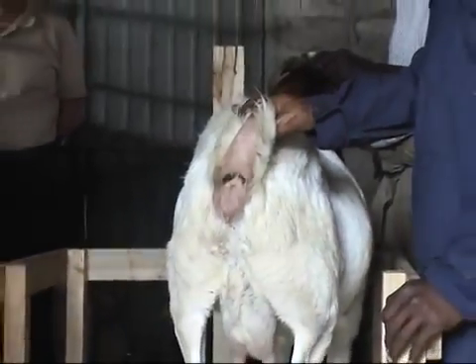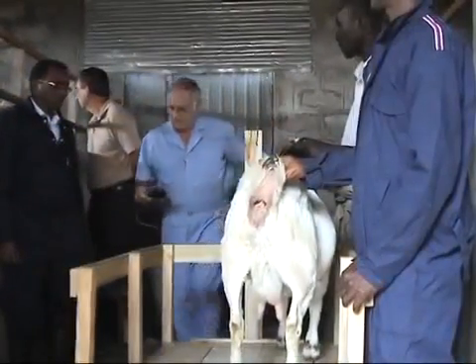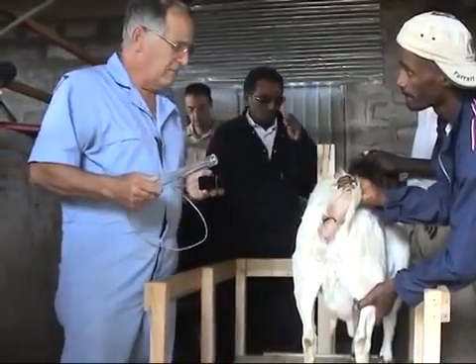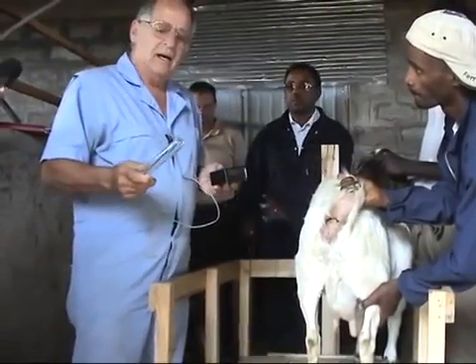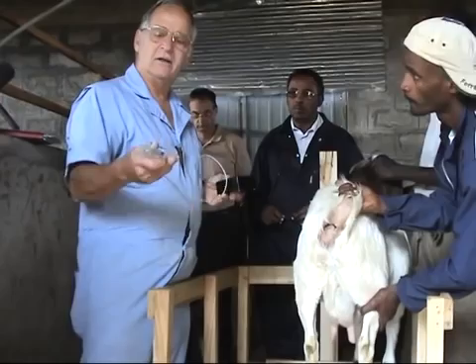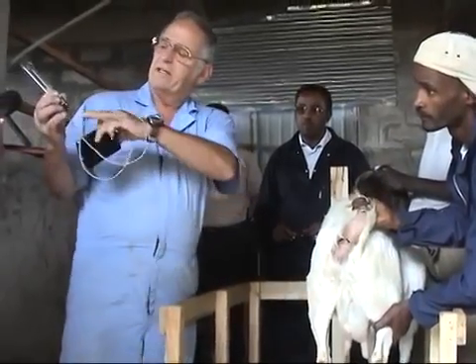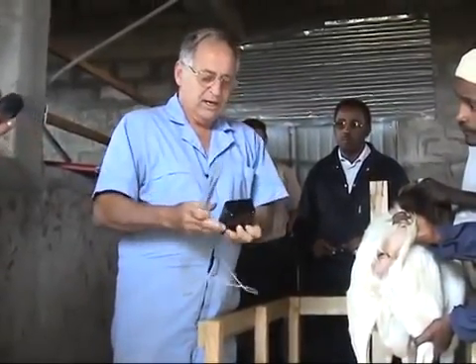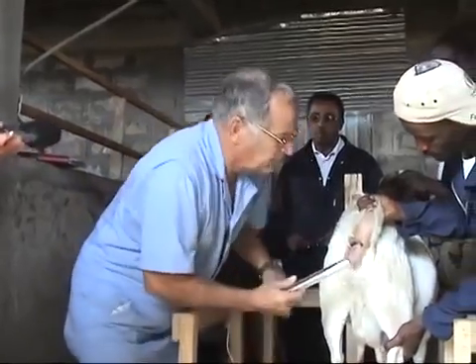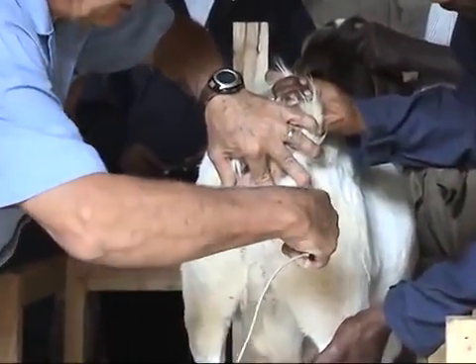We examine her inside by means of a speculum and a light source, and I'll prepare that now. The speculum comes in different sizes depending on how big or small the animal is. Usually a maiden doe will use a smaller speculum and a larger doe will use a larger speculum. The speculum is nothing more than a plastic cylinder — clear or white cylinders work. Inside is attached a clip with a portable light source so we can examine the inside of the tract. We put a little bit of lubricant on the outside to ease penetration.